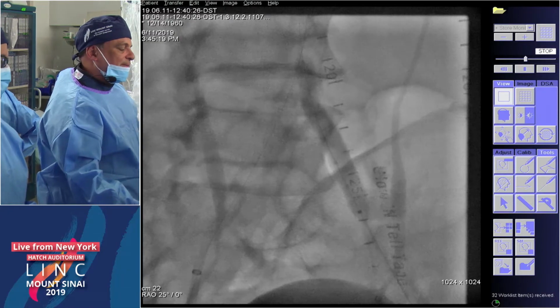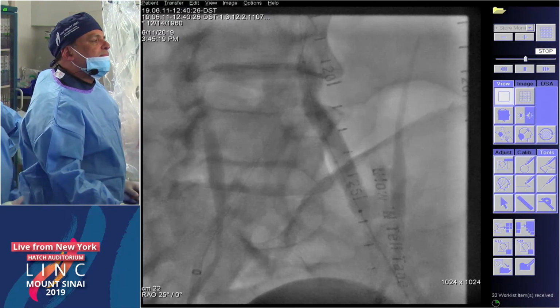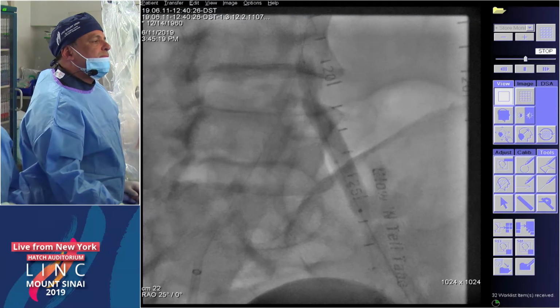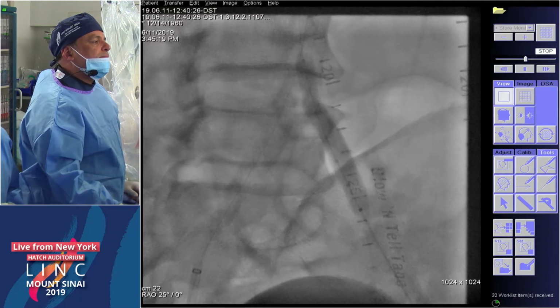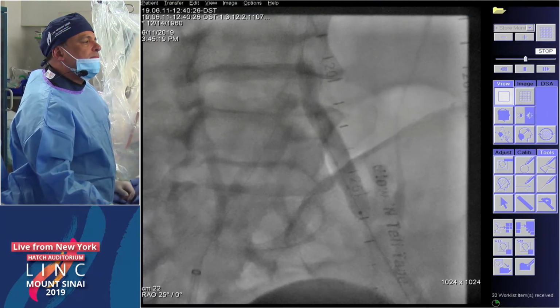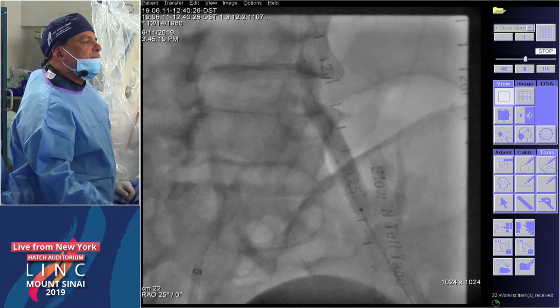What happened? I guess I stopped it. There you go. Now, would you pull it back or would you push it forward, since your mid emitter is, all the other ones are paired, so 1, 2, and 4, and 5 are kind of sharing the energy, but that middle emitter is really getting all the energy.